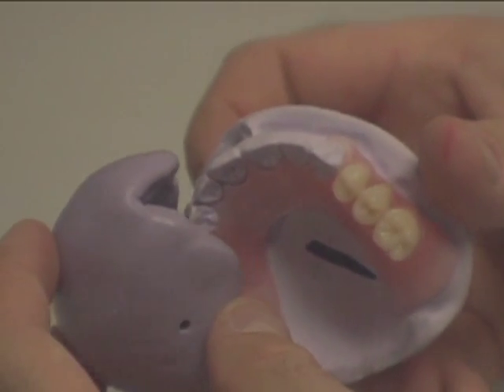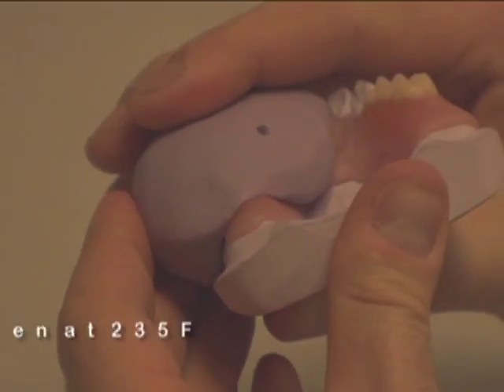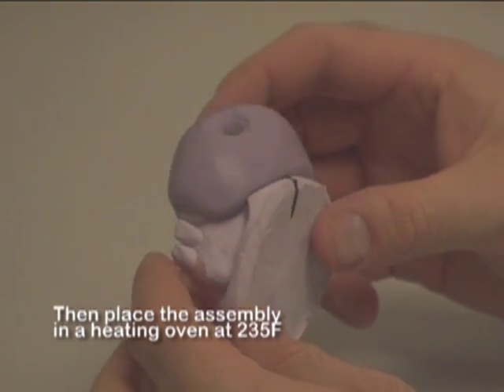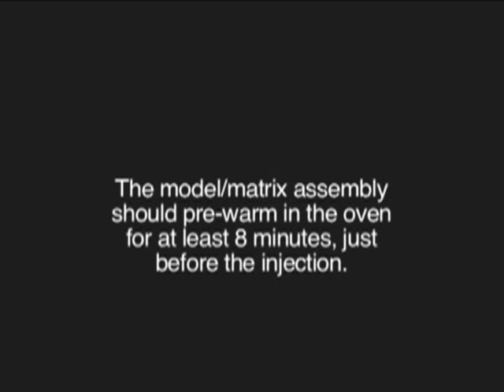Preheat. After removing all wax, place the matrix back on the model and place the assembly in a heating oven at 235 degrees Fahrenheit for 8 minutes. The model and matrix assembly should pre-warm in the oven for at least 8 minutes just before injection.